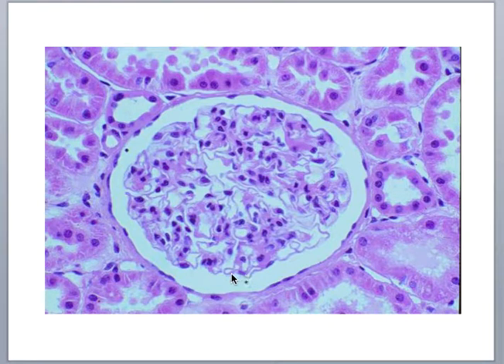So here's our first histology slide. When you pick up a kidney slide, a lot of the slides look like a whole kidney is on the slide. You can even see the bean shape to it. If you're looking for this, this is a renal corpuscle.